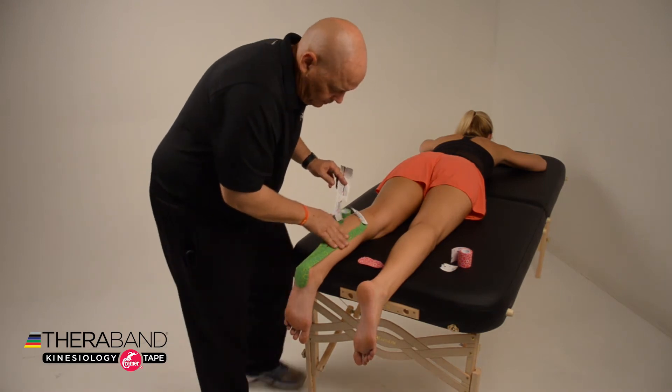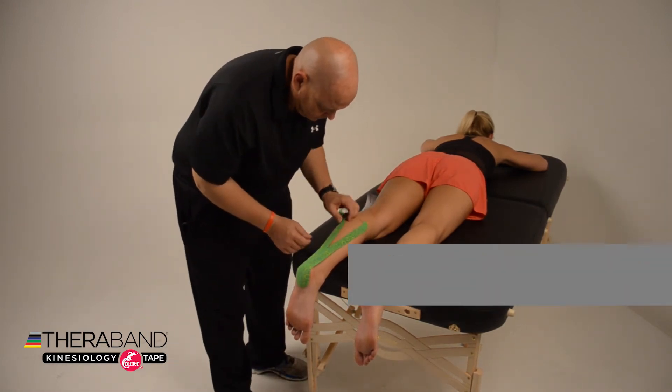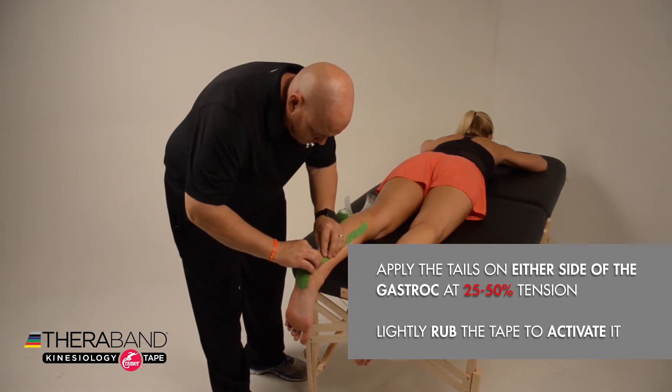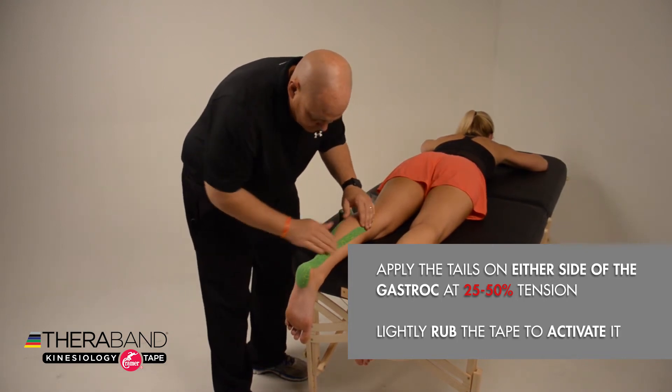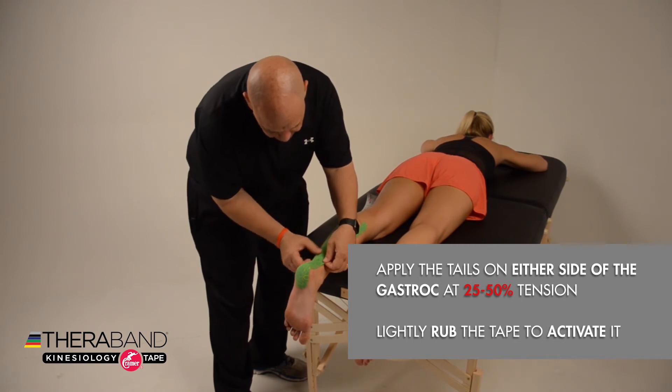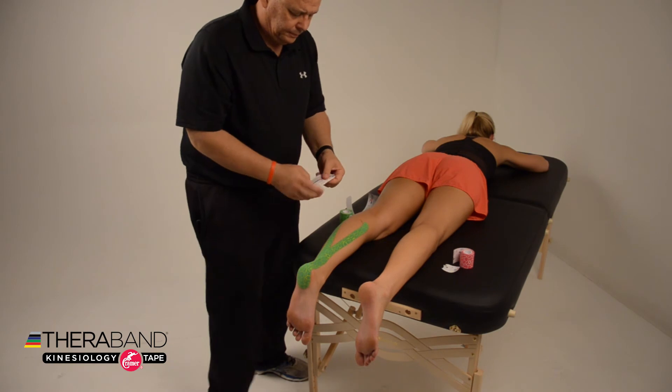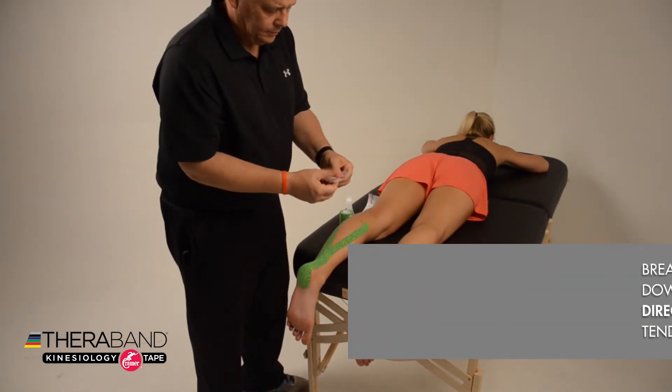Then apply the ends of the tails along each side of the gastroc with about 25 to 50 percent tension, and simply flatten down the rest of the tape. Lightly rub the adhesive to activate it.